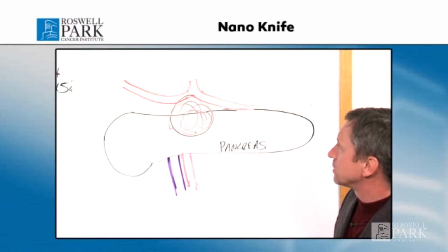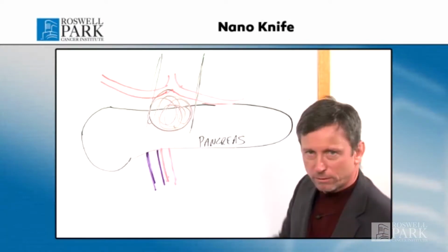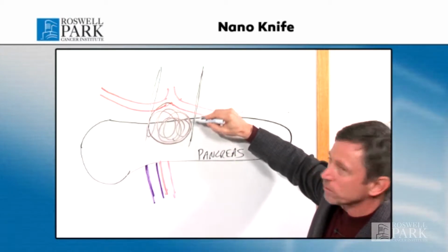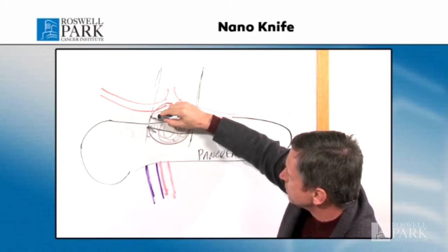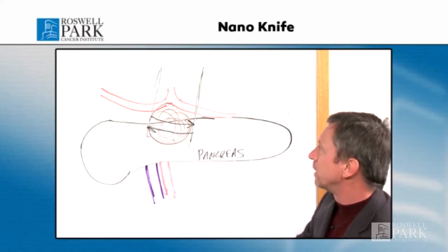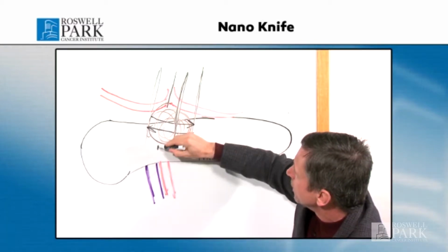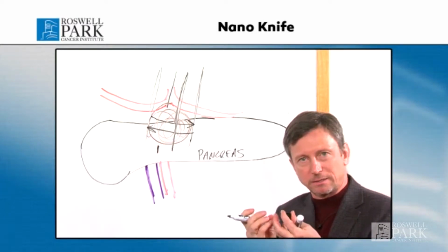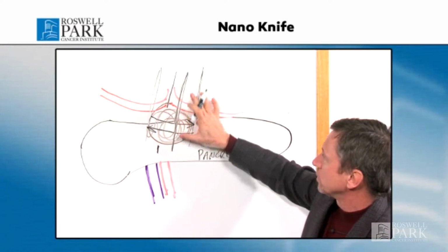The idea with NanoKnife is that probes can be inserted through the skin or through an incision directly around the tumor, and then high voltage energy is applied to these probes because it's hooked up to a generator, and essentially the current passes between these probes and treats the tumor. So the idea here is that you put the probes around the tumor. It may be 2 probes, but more frequently it may be 3 probes or even 4 probes that are bracketed around the tumor and applied to it, and then the tumor gets essentially electrocuted, for lack of a better term, and the tumor dies. So that would be one situation where it involves the blood vessels.